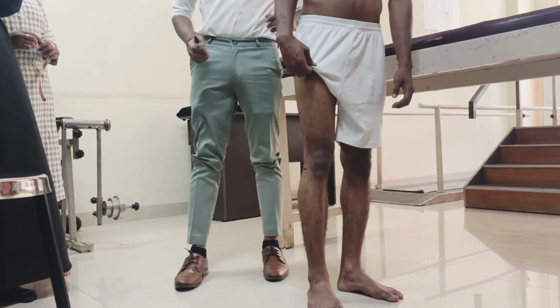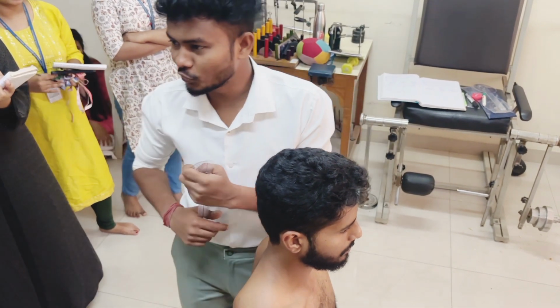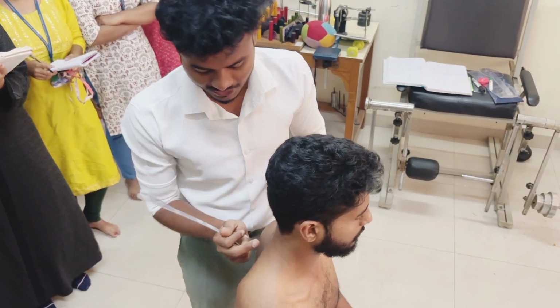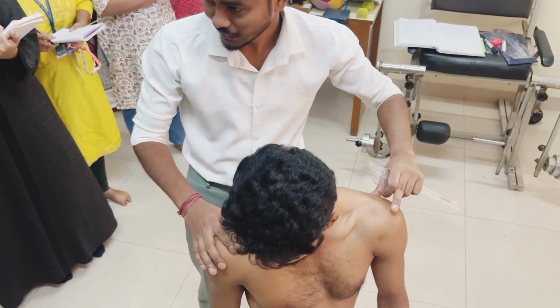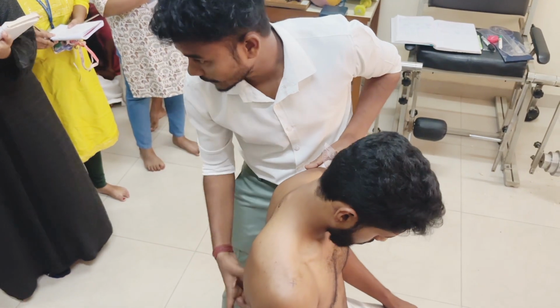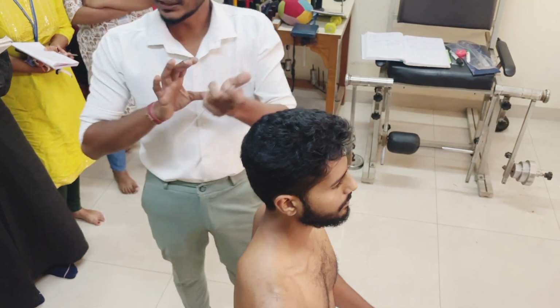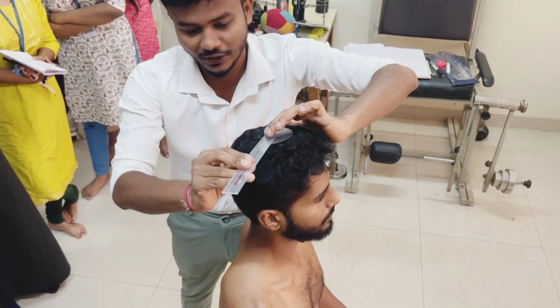Now we are going to measure rotation. We know how to measure cervical rotation. Like this, we measure cervical rotation. Now here we are going to measure the full body rotation, where the thoracic spine and lumbar spine will be involved. So the patient will be in a high sitting position. Here we keep our fulcrum over the center of the cranium.